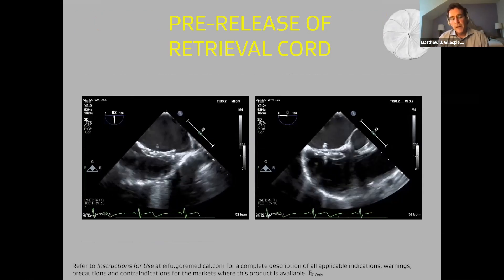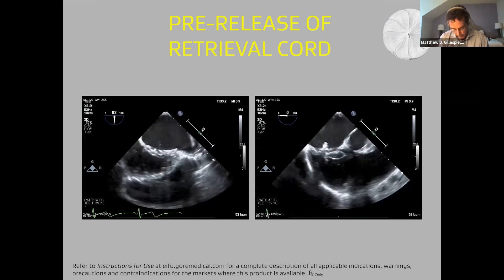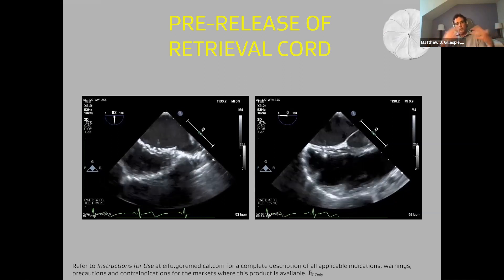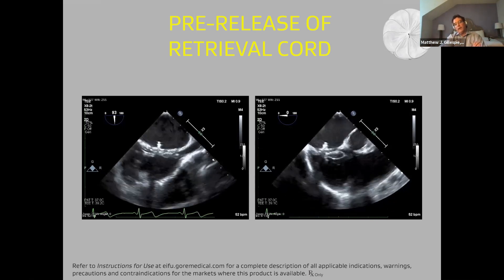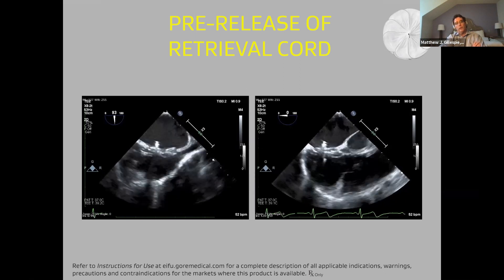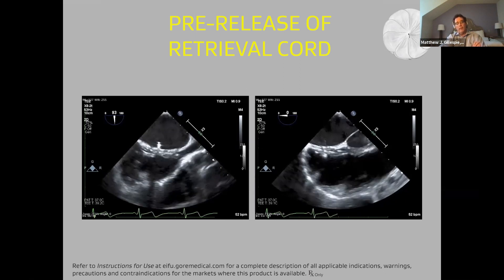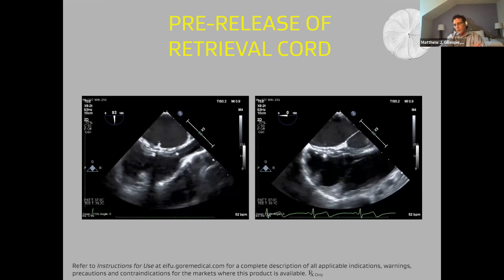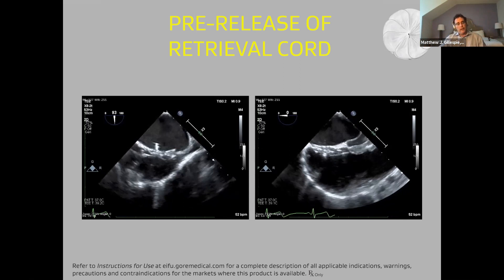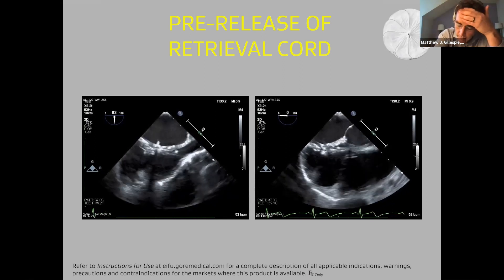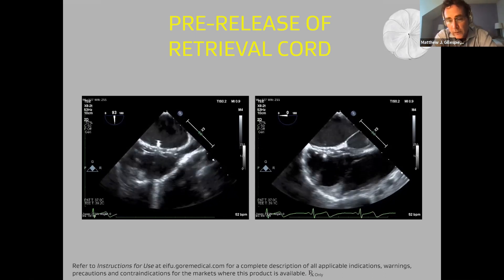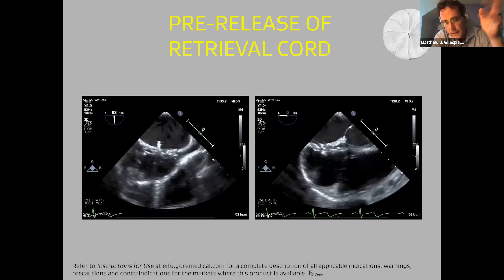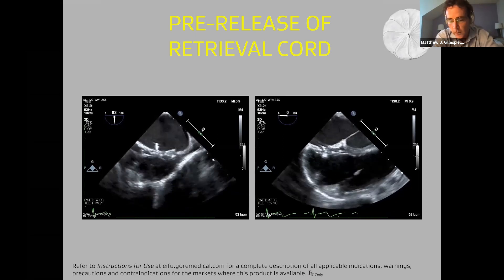The locking loop is deployed and the only thing attached to the device is the suture, which provides no support at all. You can see how flat that looks — it's a very nice result. At this point I begin my true interrogation by echo, starting in the short axis view and working around. When working with the echocardiographer, I say 'let me drive for five minutes' and tell them which views I want, then I say 'now you look and tell me if you see something.' We compare notes, and if everybody agrees, we release the device.